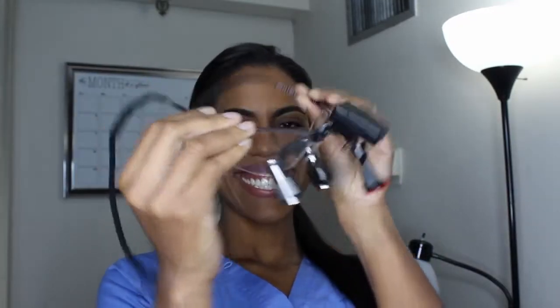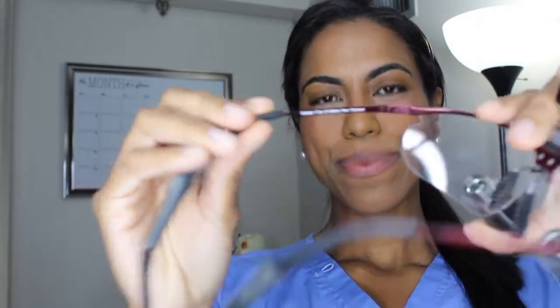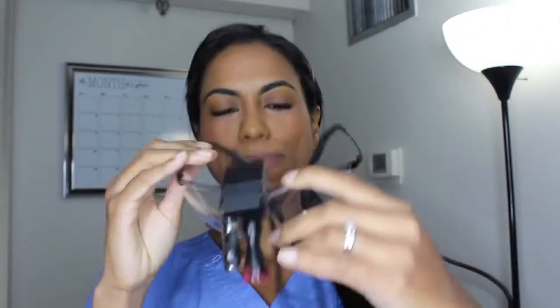QOptics, for example — these are titanium. These are the Eclipse TI by QOptics, and the frame being pure titanium is so incredibly light, it's awesome. That was one of the first things I noticed. If they feel heavy without a light, forget it — you're up a creek because once you put on the light, it already adds weight to that. So that's really, really important.